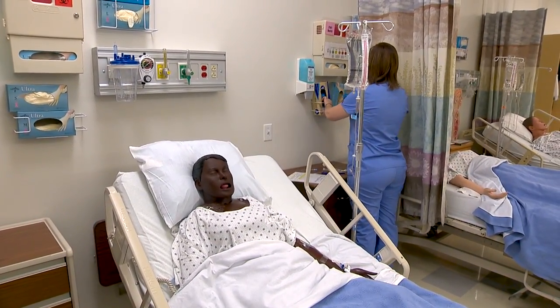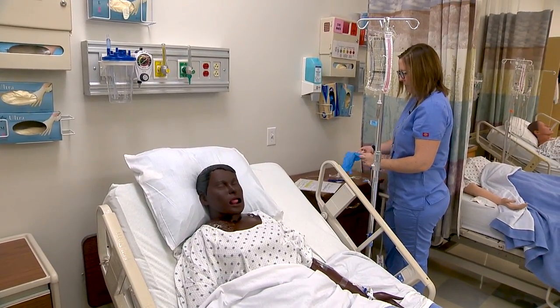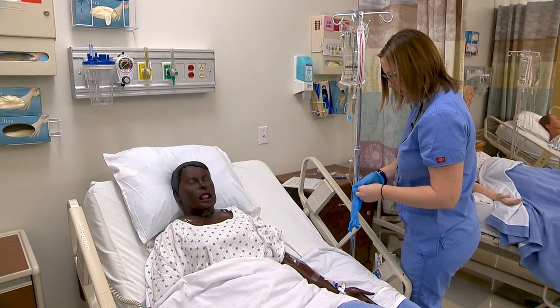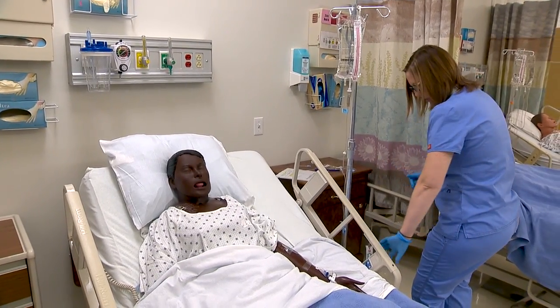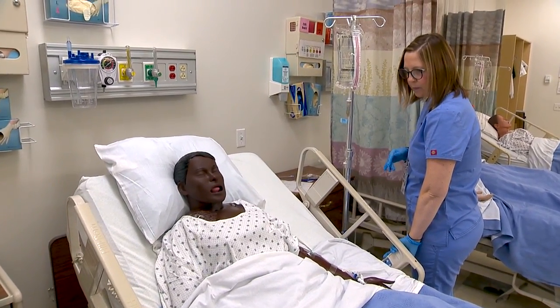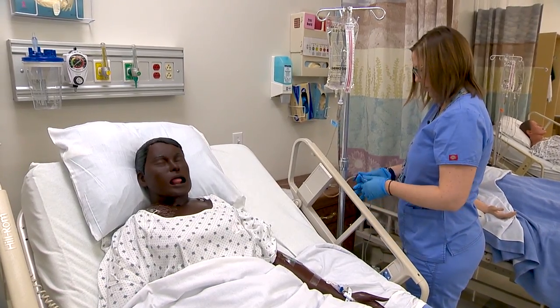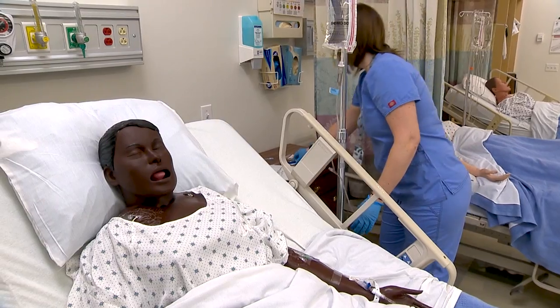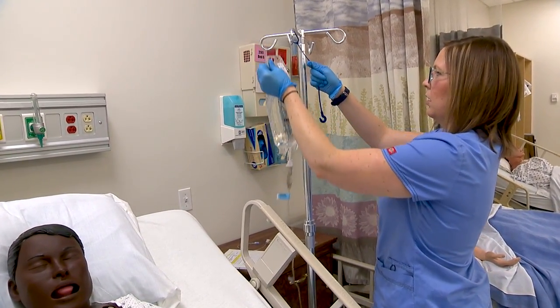Great. Are you having any burning or anything at the IV site? No, it's fine. Okay, and it looks good. I don't see any swelling or redness. I'm going to go ahead and raise the bed again so it's at a comfortable position for me. All right, and then I need to make sure that I clamp my primary tubing. Take my plastic hook. I'm going to put that here.